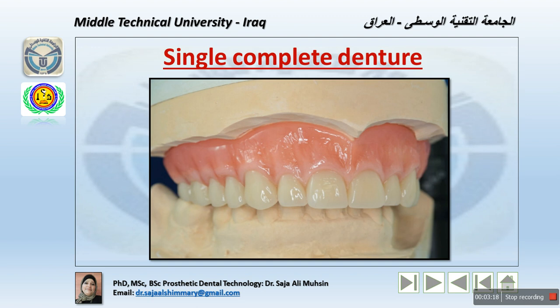We'll discuss that later. Now, maximizing the ability of the denture supporting tissue to withstand destructive occlusal forces, the denture base border should have a maximum extension within the functional anatomic limits. In this way, the forces of occlusion will be distributed over the largest possible area of the denture supporting tissue.